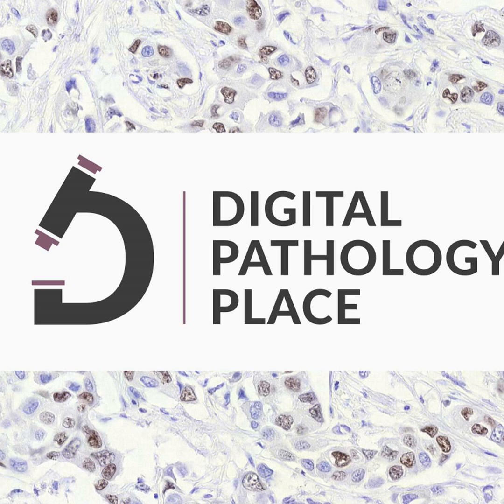But no correlation was observed between these markers at either field in pathologist assessment, which tells me let's do AI, because there should be a correlation. There is some kind of loss of precision maybe when we are doing it manually. And you already know my opinion on counting cells manually. It's not a favorable one. I don't support that. I think computers should count dots in images. So that's what they did.